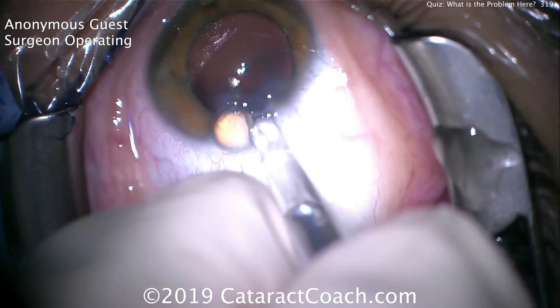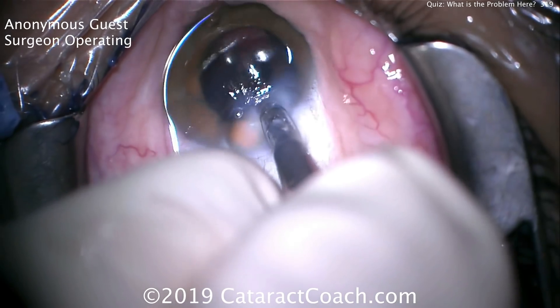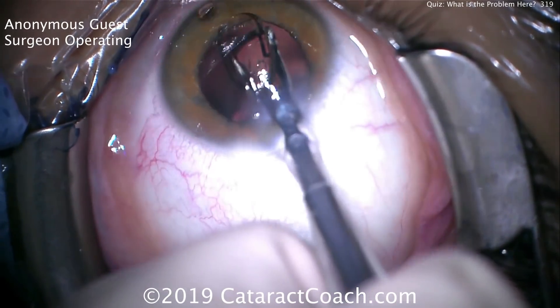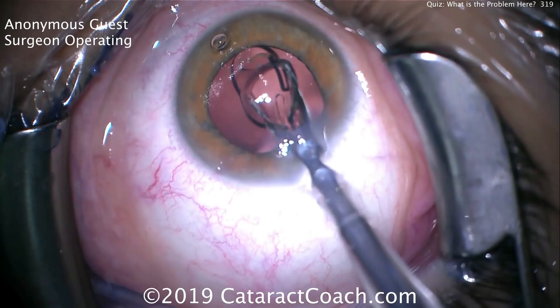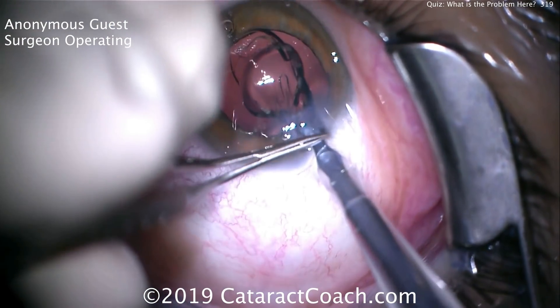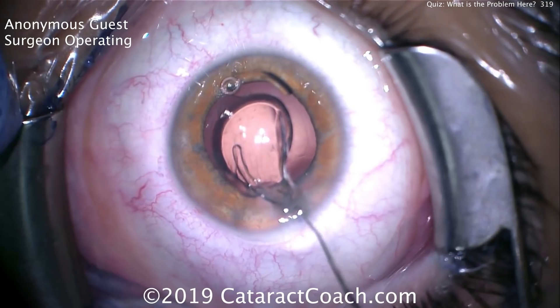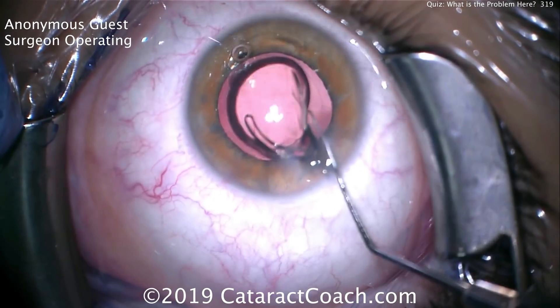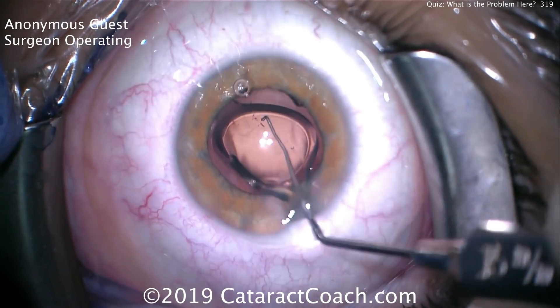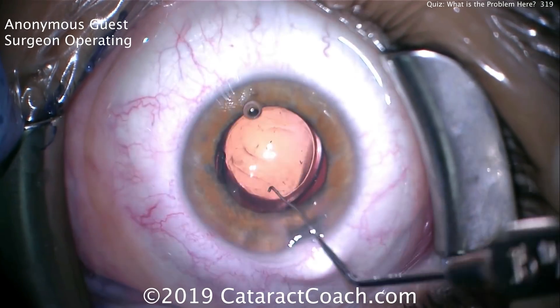Very tight incision here — maybe make the incision a little bit larger. There's an odd holding of the instrument: the left hand is holding it in a very odd grip, right hand is on the plunger. As the lens goes in the eye, what do you notice? Look at the haptic-optic junction. Is that the orientation you want, or are you starting to see a letter S? In fact, the lens is upside down. Look at the haptics — we want the anti-S, the Z, or the two-shape. This is the S-shape. That lens is completely upside down inside the eye.